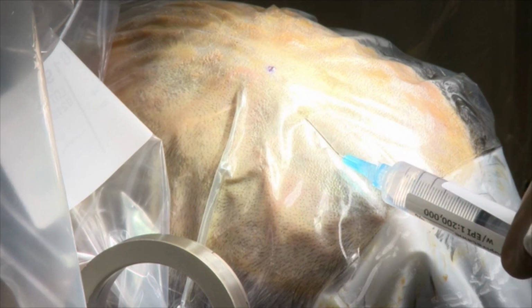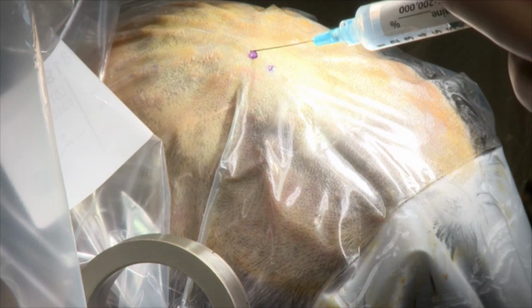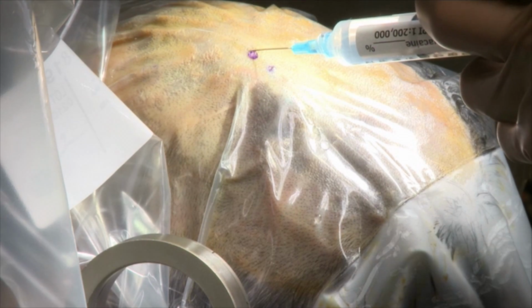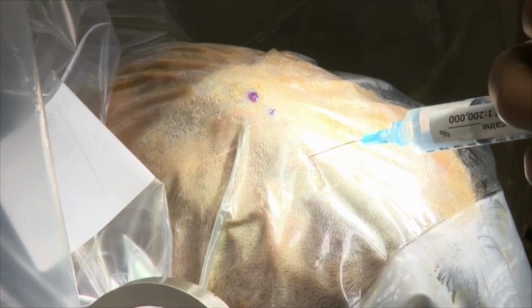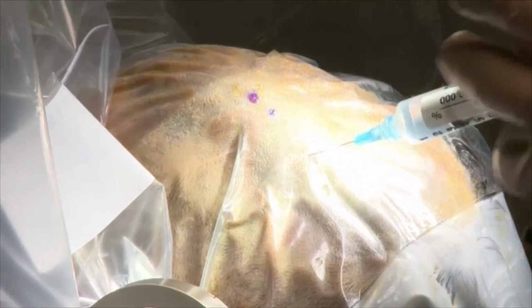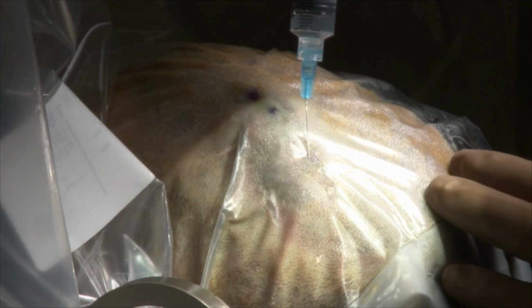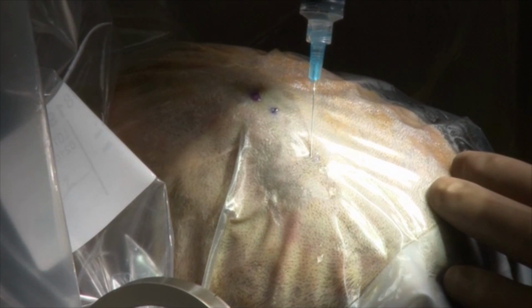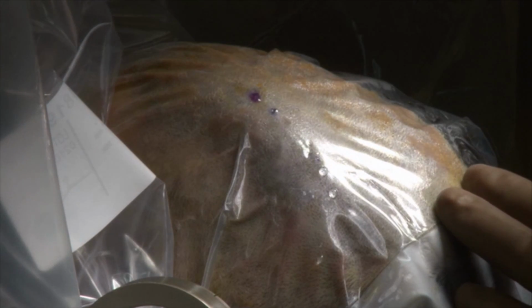And so here we are injecting numbing medication in the skin so that she won't feel the skin incision itself. We're talking to her, trying to let her know that we're injecting the medication. The anesthesiologist may well have given a little bit of sedation medication during this time as well. We try not to use too much medication because that medication can actually suppress the tremor and make it harder to know how well we're doing once we place the electrode.